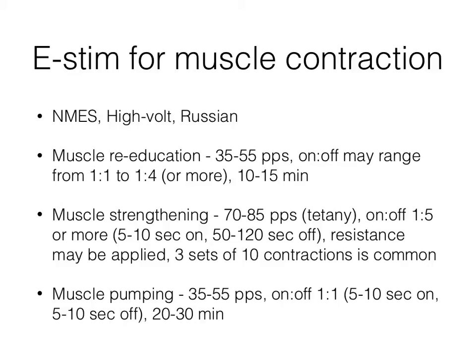So depending on the ratio is sort of up to the patient's comfort tolerance, may be limited by their fatigue and really what your goals are. And this type of treatment usually lasts for about 10 to 15 minutes before the patient gets fatigued or just sort of bored with the treatment.